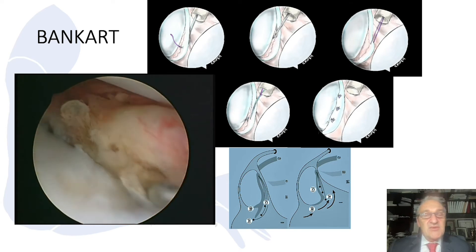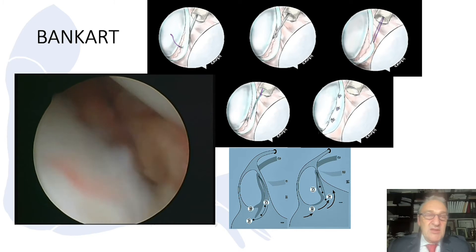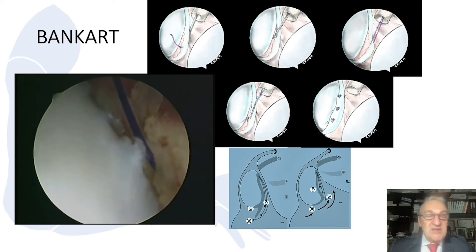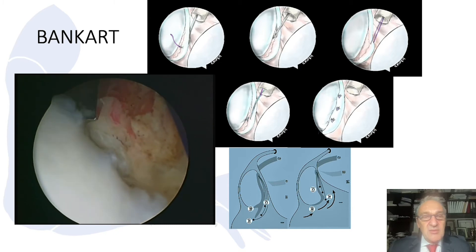Many companies have different suture passers. The first one is the Spectrum, then we have the Ideal Hook, Lassoloop and other devices. With this traction suture, we try to pull the labrum superiorly and we can see any external adhesions present.